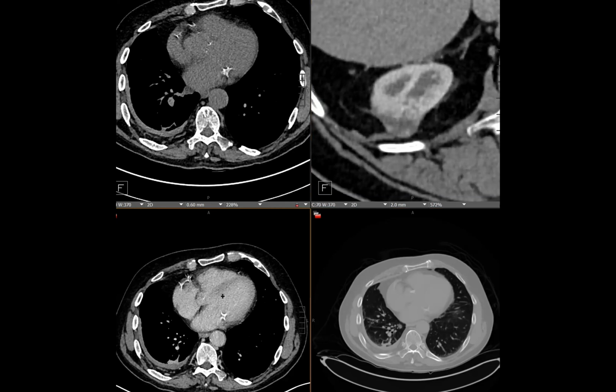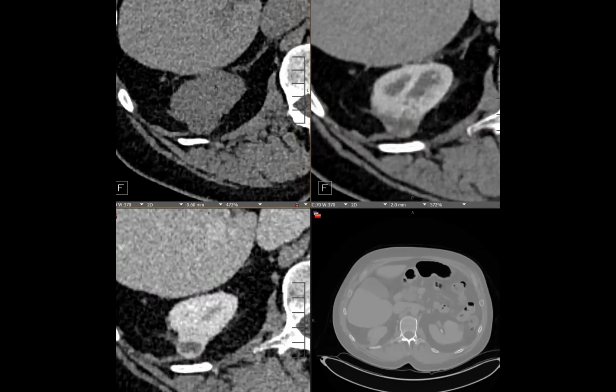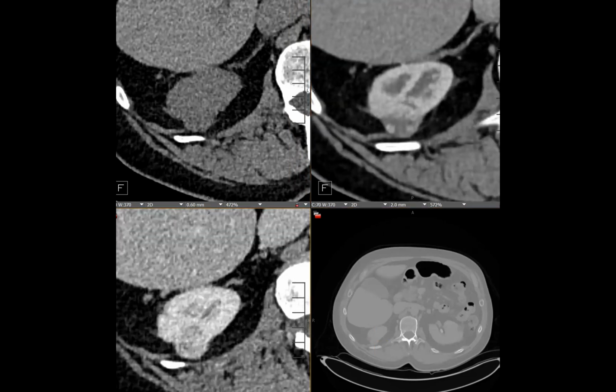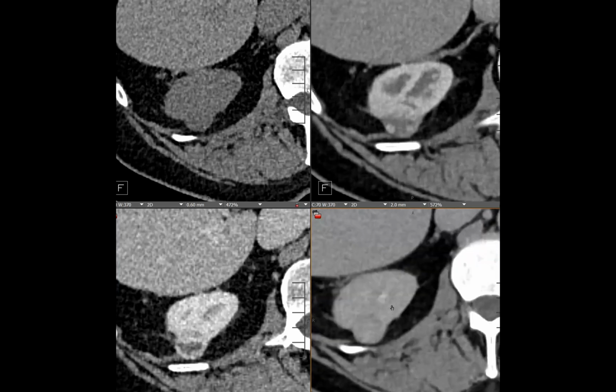Right there. And let me give you, we have a 10-minute excretory. Any thoughts from anybody? My thoughts are, what's the idea for surveillance here? What do you mean? Because what you're showing us looks like a lesion that could be operated upon because it has a differential that includes RCC.